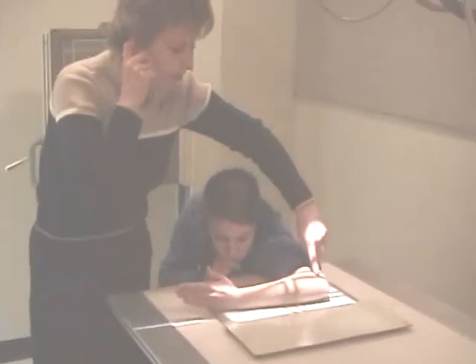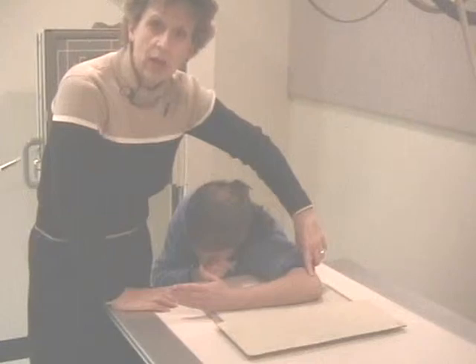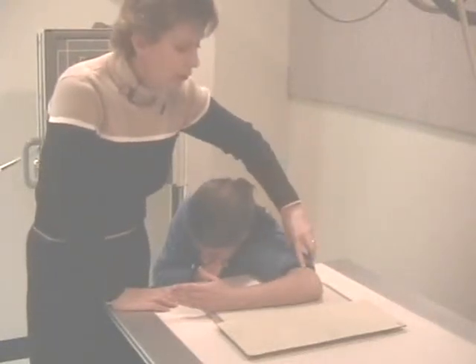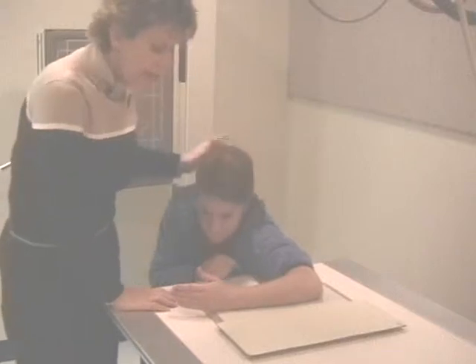The elbow will look like it should be projected with the epicondyles perpendicular, one right on top of the other. It'll look like a round, penny-type shape with the radial tuberosity in profile. Okay? We'll let our patient relax.